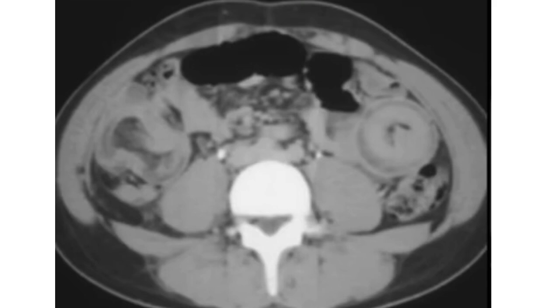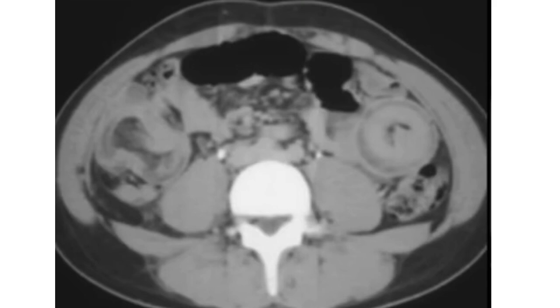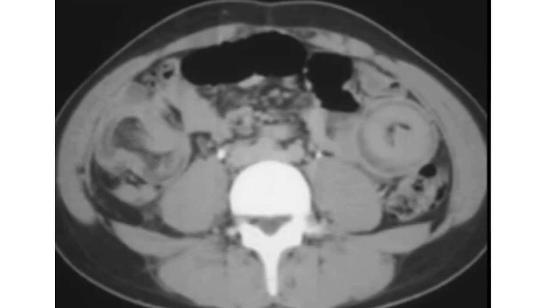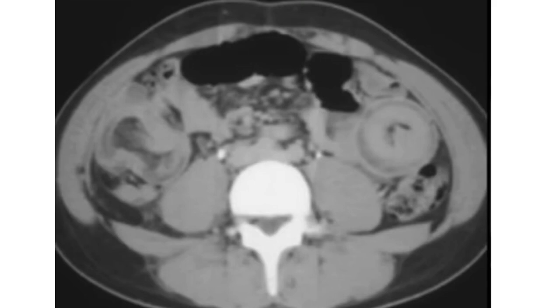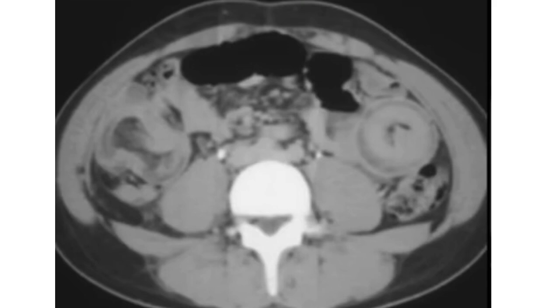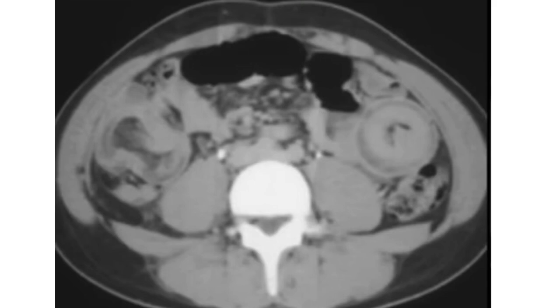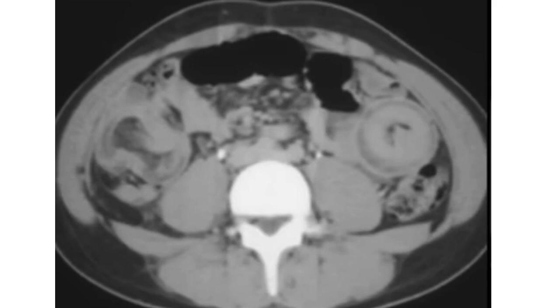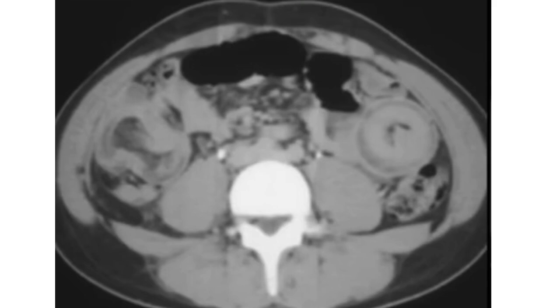This is consistent with intussusception. This patient has multiple intussusceptions. The causes of multiple intussusception can be malignant causes or functional causes. In the malignant causes, it is due to tumors like adenocarcinoma, lymphoma, and metastasis. In the functional causes, it can be due to celiac disease or Crohn's disease.